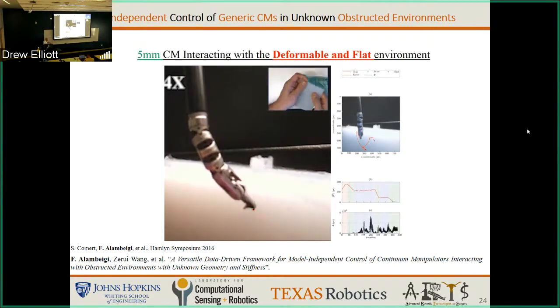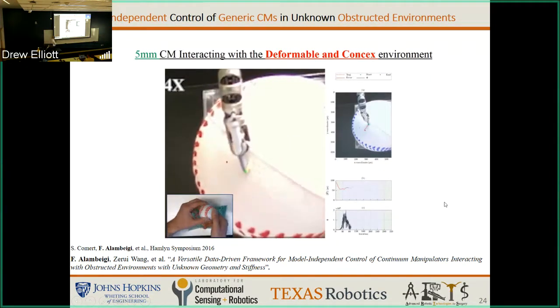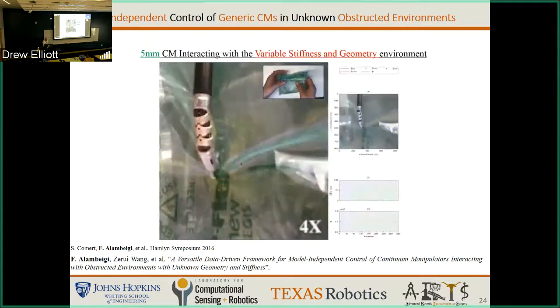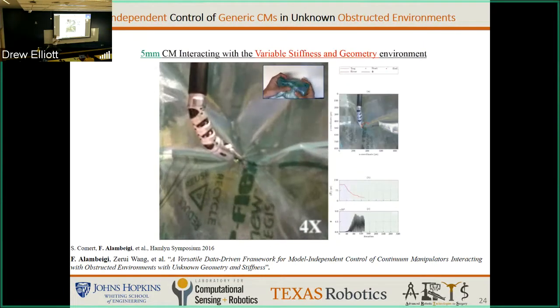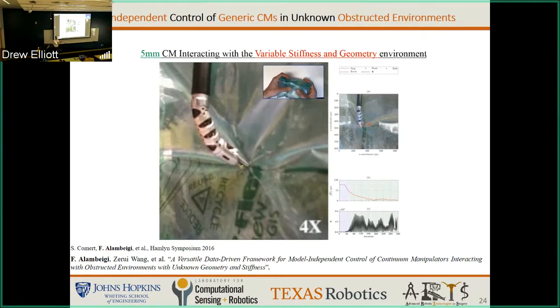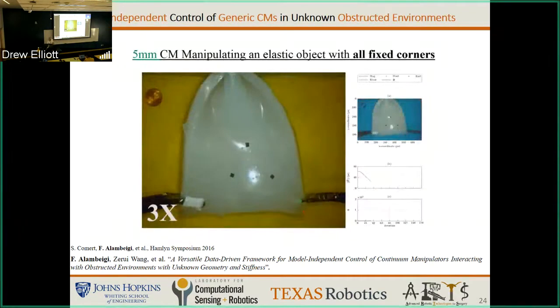And still it can deform. And the most challenging one, so this was again a concave ball that we tested. And look at that estimation, still fast but it can capture. And the last one was the challenging one. You find these in Amazon packages, right? The challenge is that if you push up to some point, the air is trapped inside and it becomes stiff. Before that it is soft. So it is very hard to estimate, but it was flexible too.